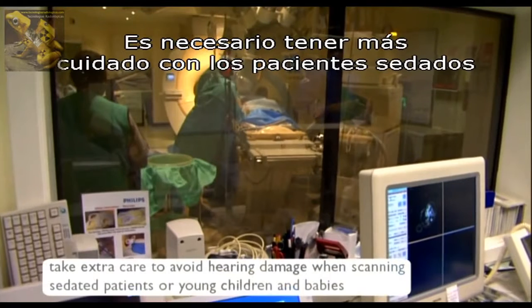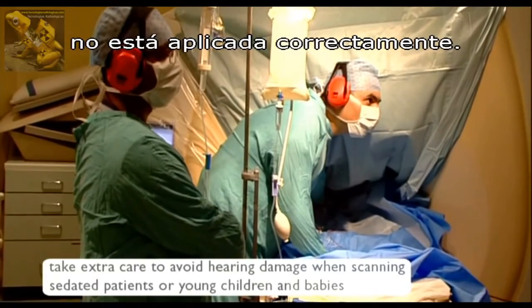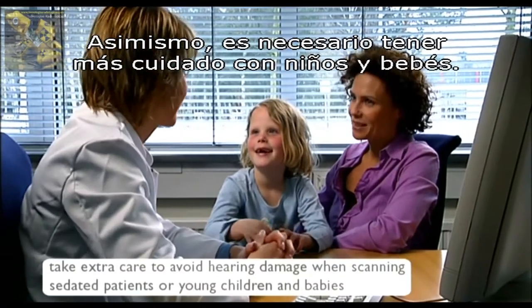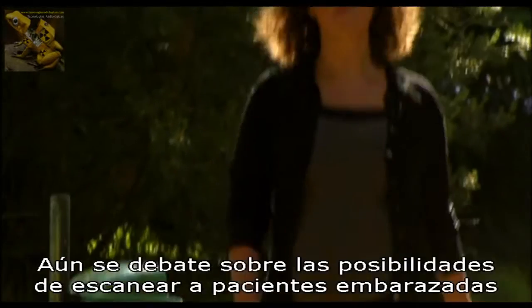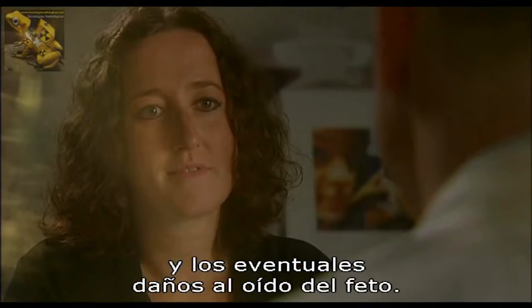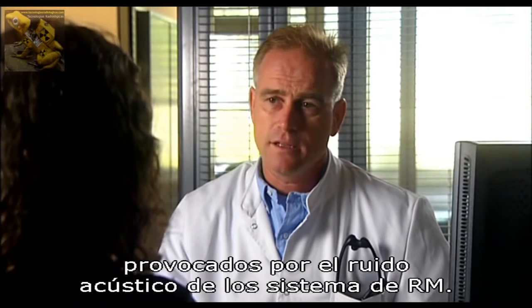Extra care must be given to sedated patients because they cannot indicate that the hearing protection is not applied correctly. Similarly, extra care is needed for young children and babies. There is still an ongoing debate about scanning pregnant patients and potential hearing damage for the fetus, though so far there have been no reports of negative effects of the acoustic noise of MR systems on the fetus.